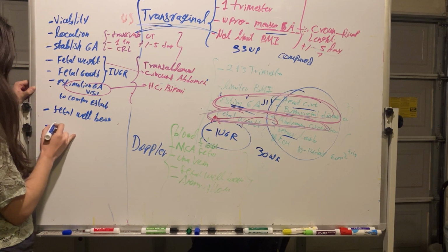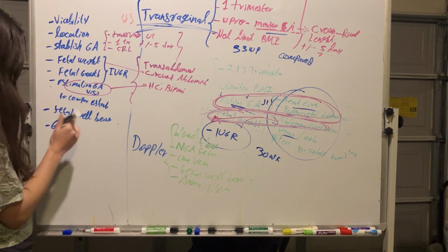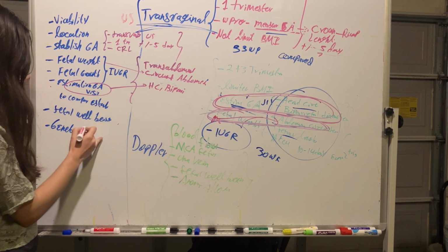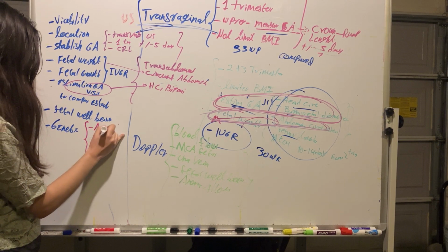We do a genetic ultrasound. The genetic ultrasound is to evaluate for aneuploidy.